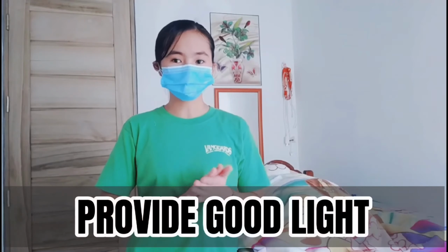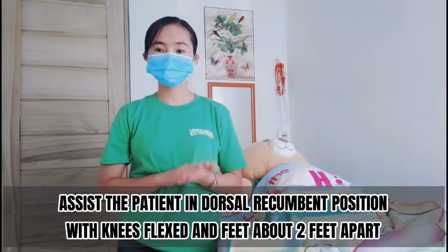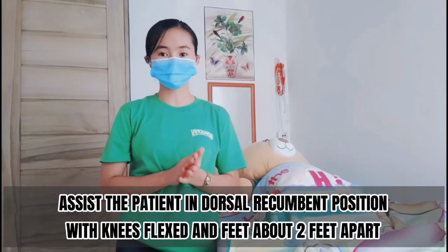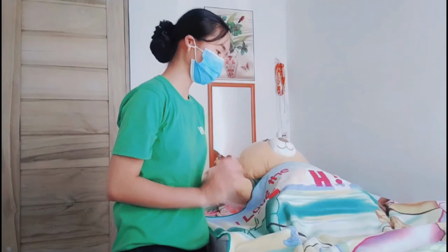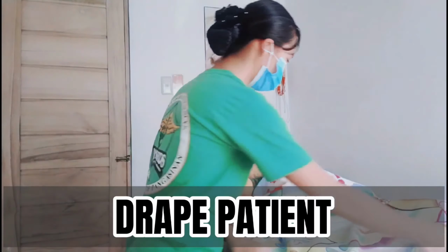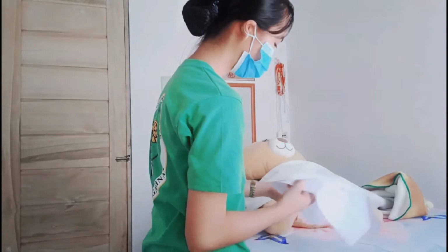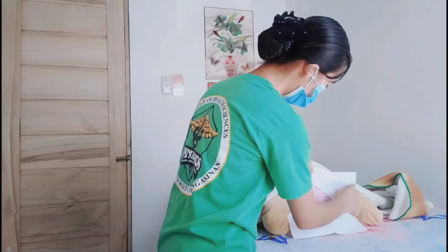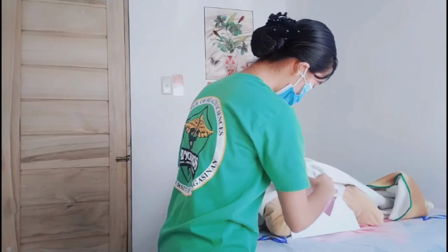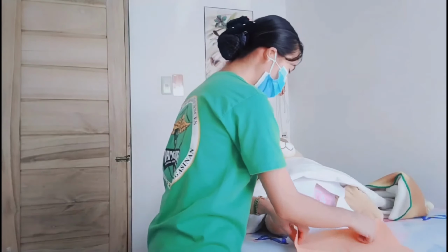Then we are going to provide good light. This is necessary to see the meatus clearly. Then provide privacy by closing the curtains or door, because catheter insertion may be embarrassing for the patient. Place the patient in dorsal recumbent position with knees flexed and feet about 2 feet apart, because good visualization of the meatus is important. Then we are going to drape the patient. Remember that embarrassment, chilliness, and tension can interfere with catheter insertion. I'm going to slide a drape under the patient. This is to protect the bed linens from moisture.